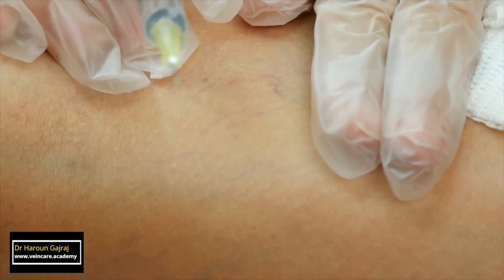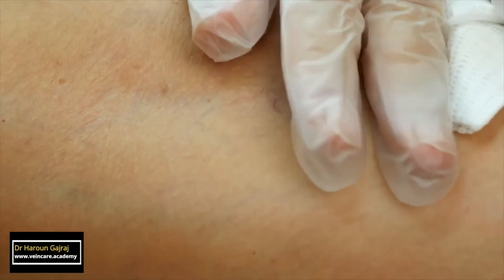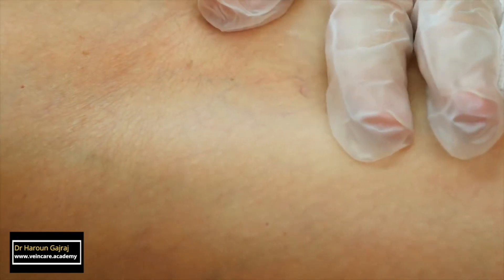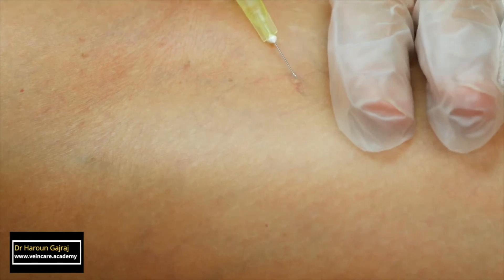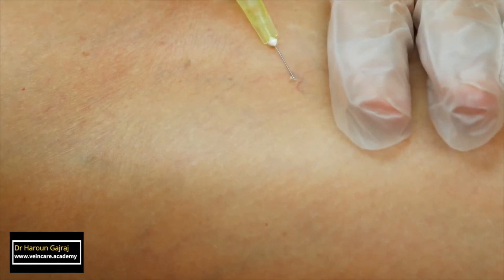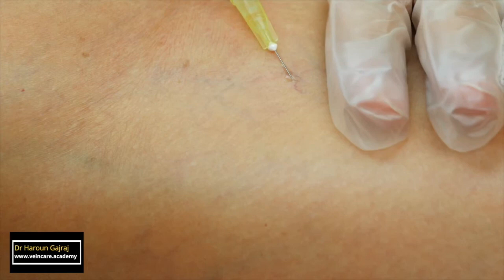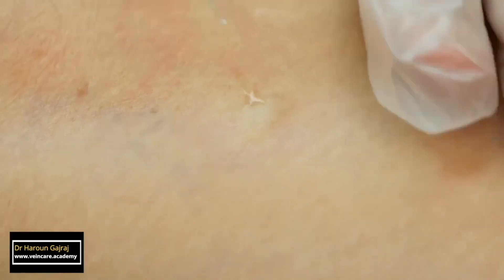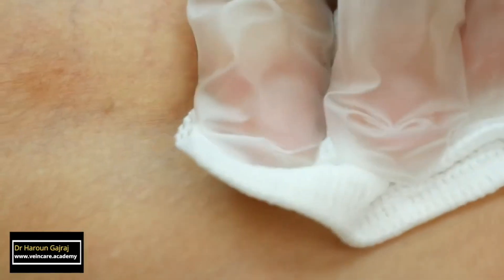From time to time, even the most experienced and expert practitioner will inject outside the vessel. A bleb indicates that the injection must be stopped immediately. Other warning signs to stop include pain on injection and blanching of the skin — this is not to be confused with blanching of the vessel. Blanching of the skin indicates that a small arteriole or an arteriovenous shunt has been injected, and if you continue injecting in this situation, you'll get very severe skin loss.